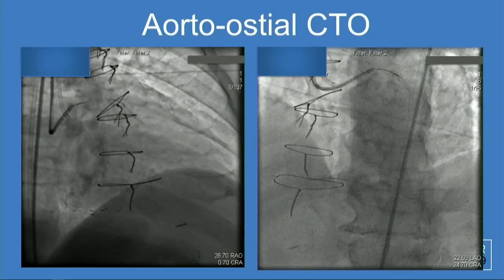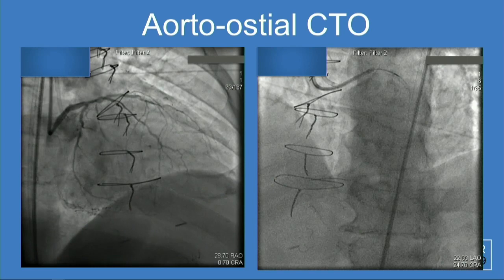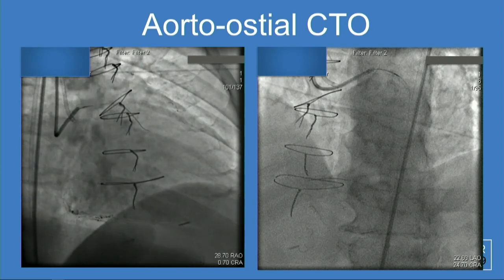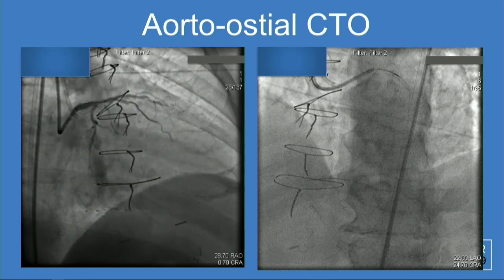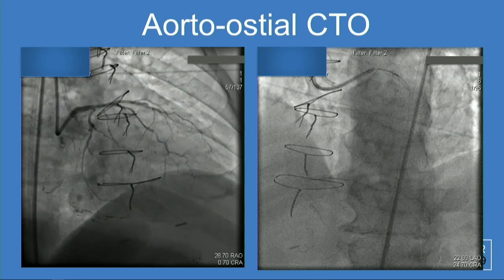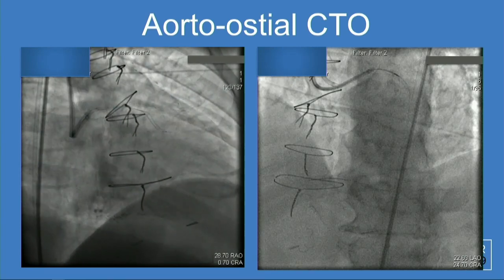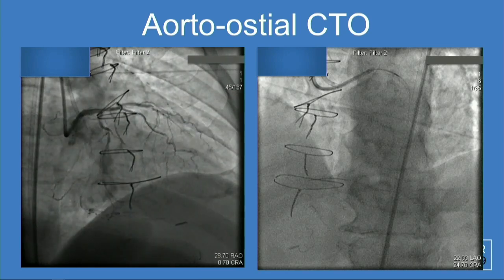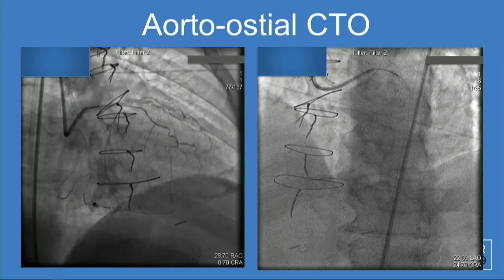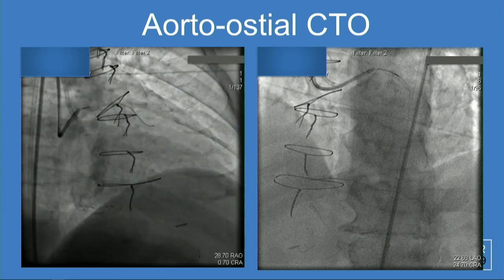This is a case I did several years ago. It's a gentleman who had previous bypass surgery, and at his bypass they used a gastroepiploic artery for his right. He had gastric bypass surgery about 3 or 4 years ago, and you can imagine what happened. They clipped the wrong vessel. He ended up having an inferior infarct, fortunately survived it, but survived to have class 3 angina that was really unremitting despite multiple drugs. And so I brought him in with a plan of doing a retrograde approach.